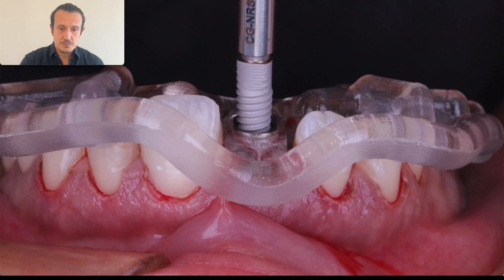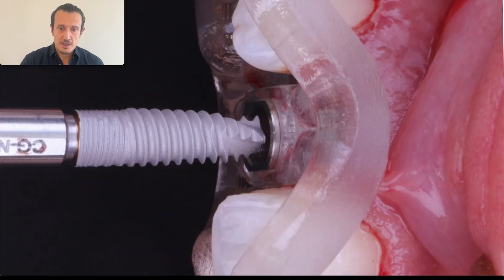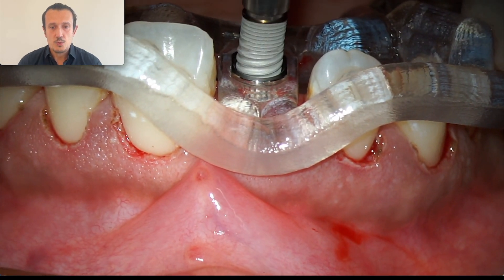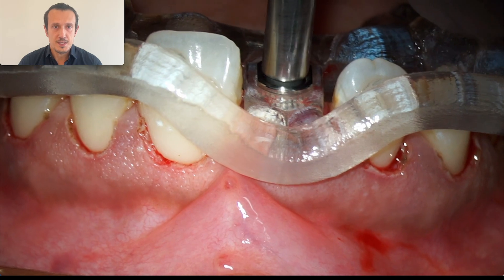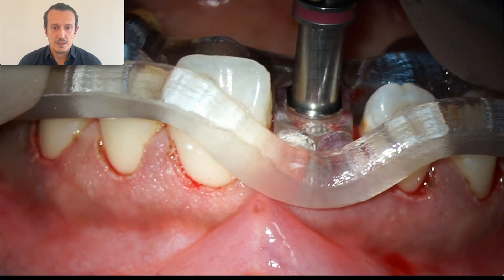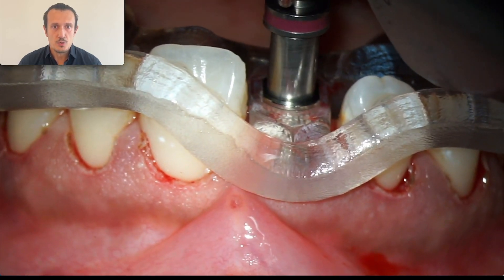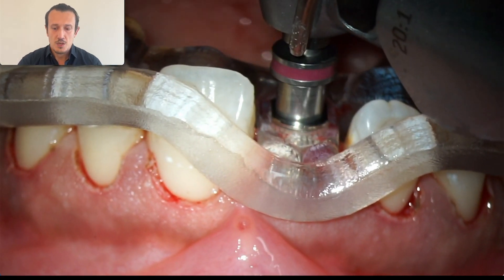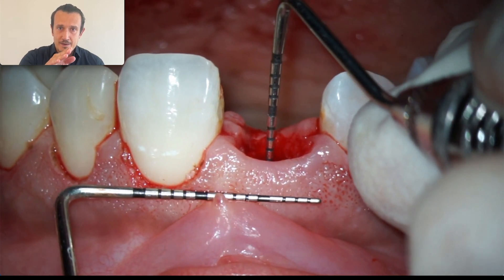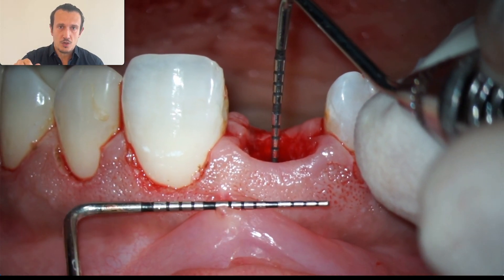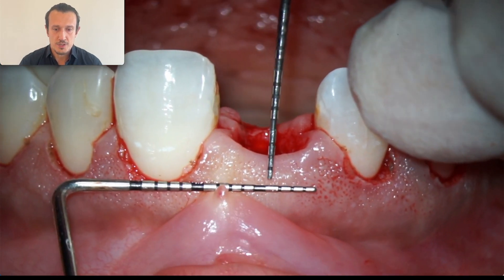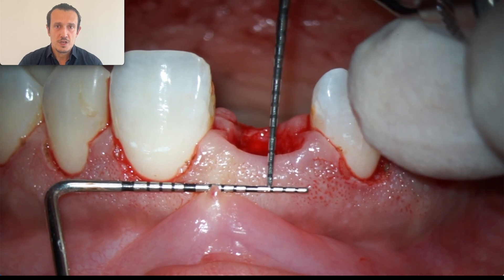Using this reference, we're going to insert the implant. After we insert the implant we need to check again what the depth of this implant is. Remember, in this case we're not going to relate the depth of the implant to the existing soft tissue margin — we are going to use the soft tissue margin of the contralateral incisor that we just exposed with the crown lengthening procedure.